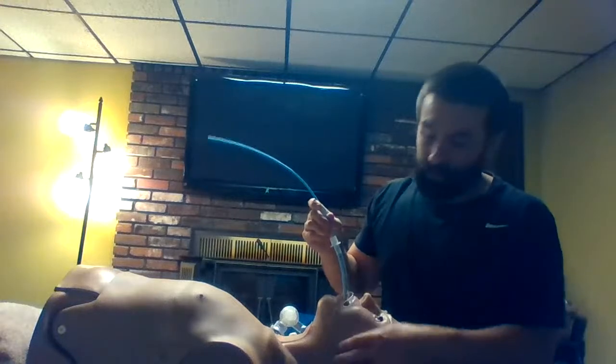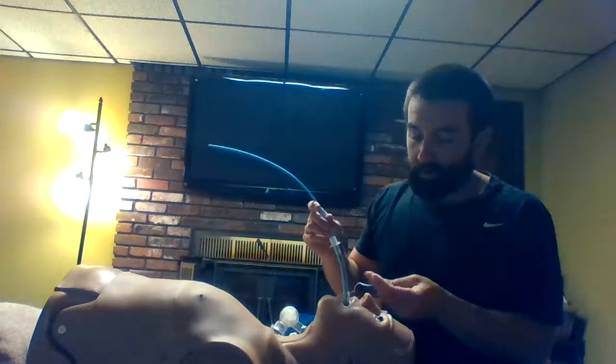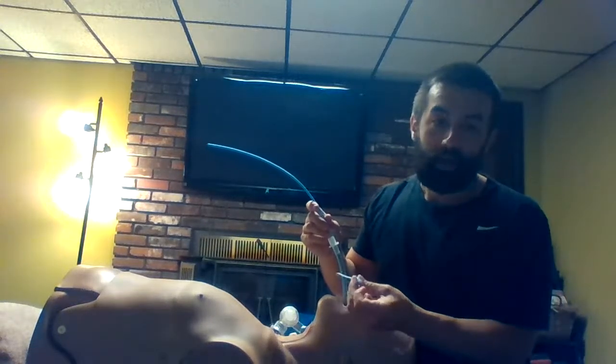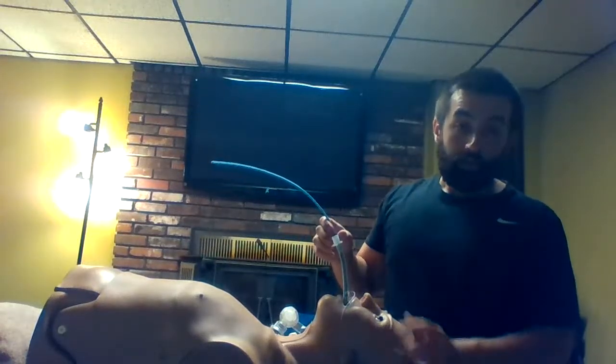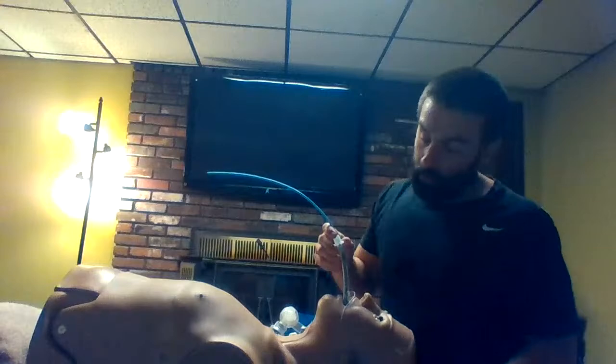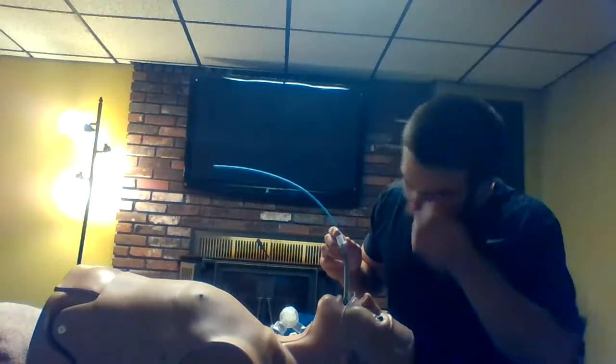If you weren't really sure, you could still have somebody deflate this cuff down, but you can squeeze that pilot balloon and tell there's a big rupture on this thing. So I'm going to go right until I'm at the end of the tube. In real cases, you could look at the unit of measurements right there on the side and line up 29 and 29 or whatever. All right.